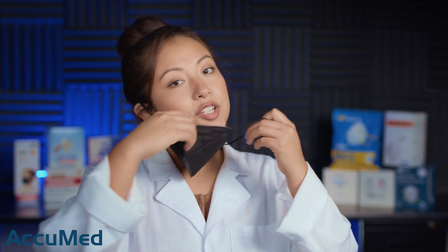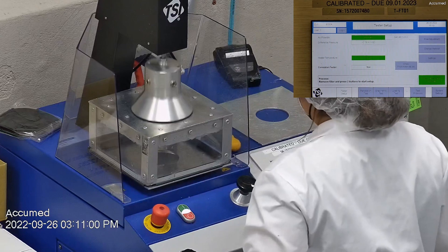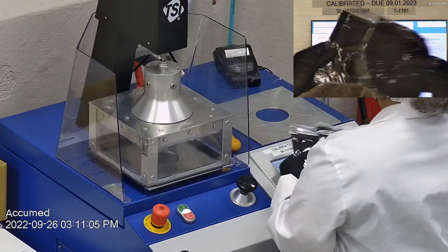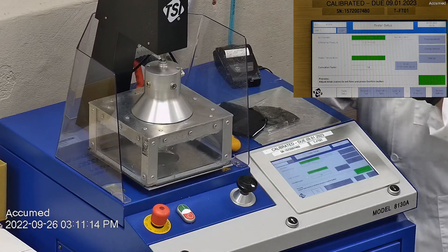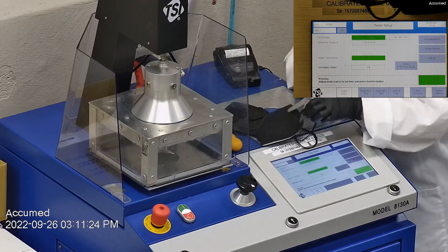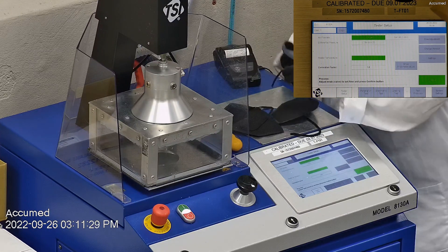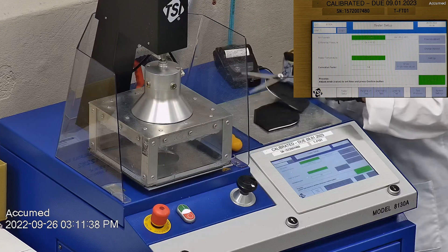Let's go ahead and see how these test on our TSI machine. We're going to be testing both the filtration efficiency and pressure drop. This is our TSI machine, model 8130A, which is the same filtration testing machine that NIOSH uses to approve N95 respirators. Our procedure is also inspired by NIOSH. We first run a tester setup and start by removing the headband from the respirator before placing it onto the testing plate to ensure a proper seal.